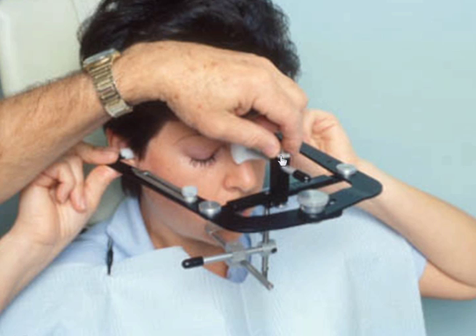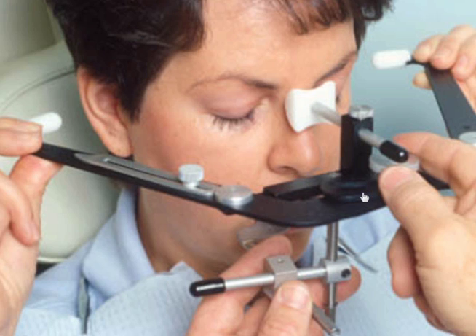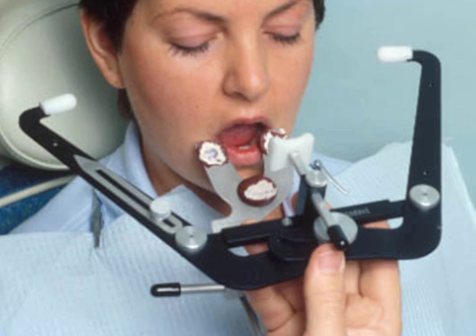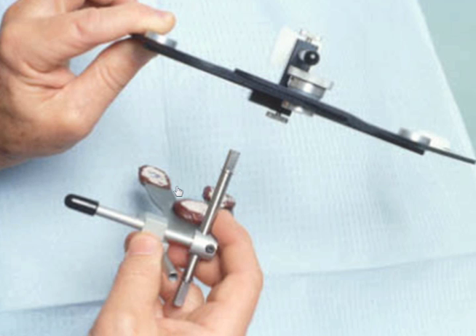We can then loosen the small screw here on the top, and then loosen the large screw here in the front, instruct the patient to retract the earplugs out of their ears, and open their mouth so we can remove the Facebow from the patient. We can then loosen the screw here on the crossbar to remove the bite fork assembly, which will be sent to the laboratory for mounting the upper cast to the articulator.